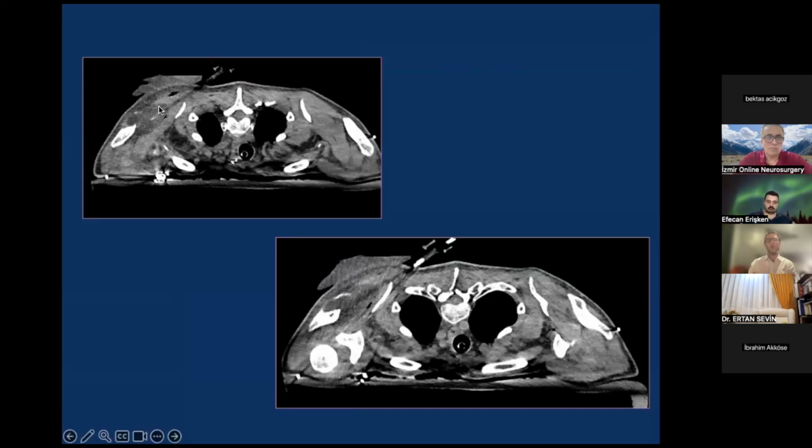And afterwards, we did the cryoablation. So you can see when you are doing CT acquisition, you can see live the ice ball, which is generated by the cryoablation, and you can control the extension of your ablative therapy. And here we used a glove with hot water to avoid a skin burn lesion, because this lesion was very close to the skin.